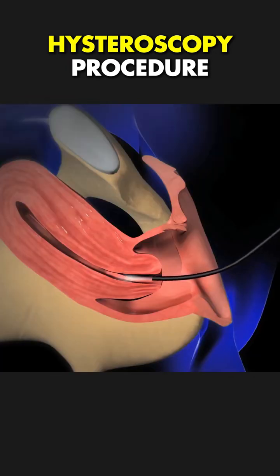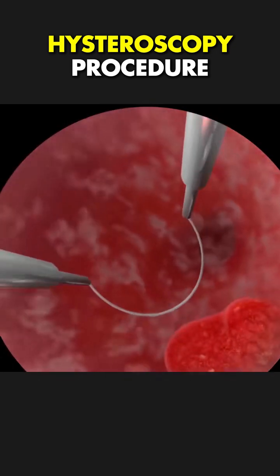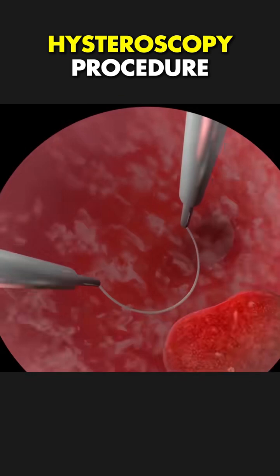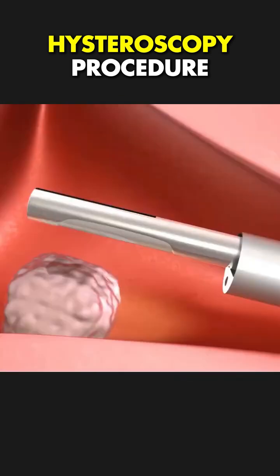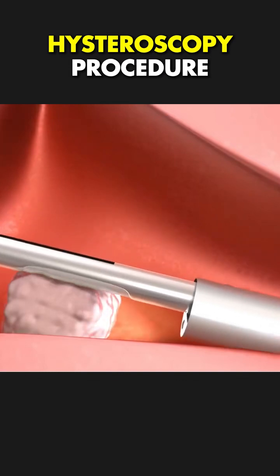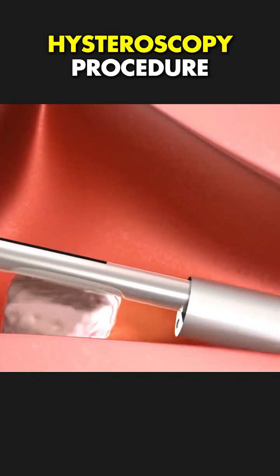The doctor carefully examines the uterus, and if polyps or fibroids are found, special surgical tools are passed through the hysteroscope to cut or remove them. For larger fibroids, a technique called hysteroscopic morcellation may be used to break them into smaller pieces for easy removal.